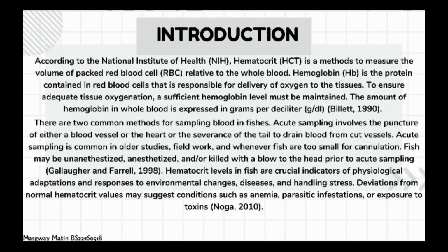Hello, my name is Maswe Martin, and I will be showing you the introduction to the calculation of hematocrit in fish. According to the National Institute of Health (NIH), hematocrit (HCT) is a method to measure the volume of packed red blood cells (RBC) relative to the whole blood.